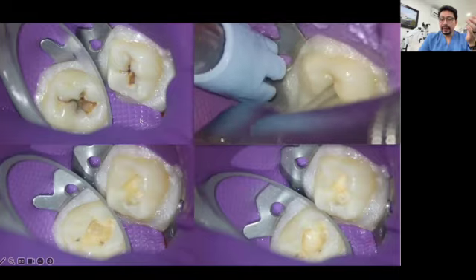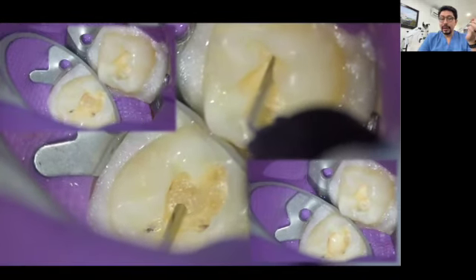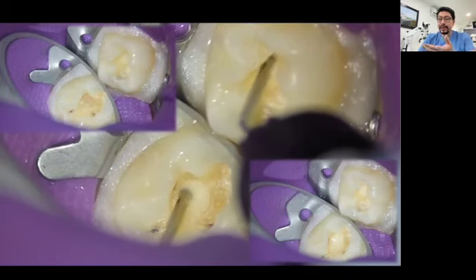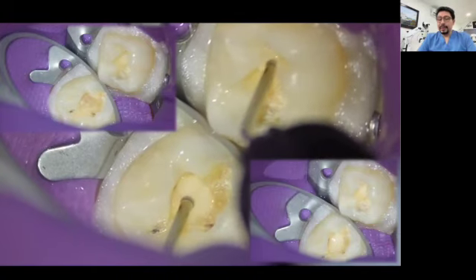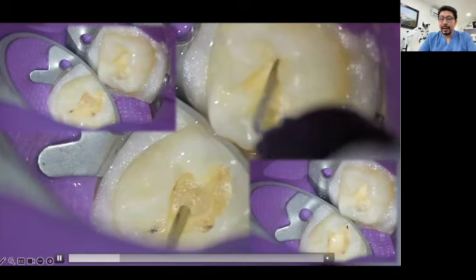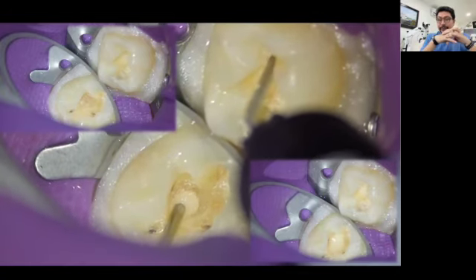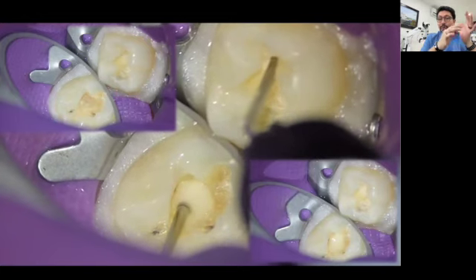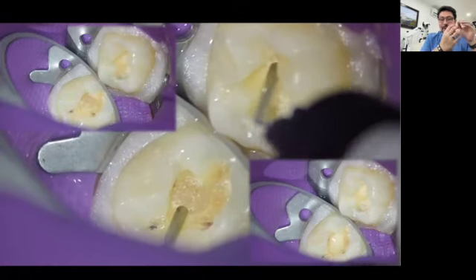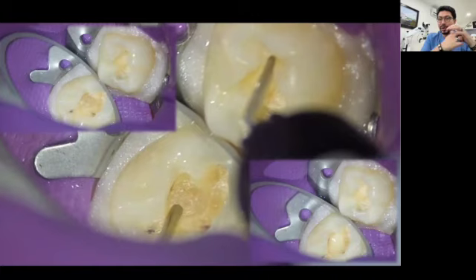And we will have the chance to be more conservative with our treatments. We can analyze even how deep we are inside of dentin, because remember, guys, that the pulp and the dentin are strictly correlated. That's why you call them the pulpodentinal complex. As soon as you touch the dentin, you are already generating some reactions inside of the pulp.